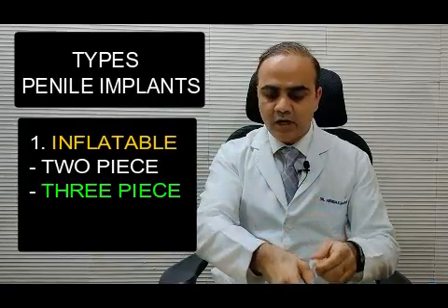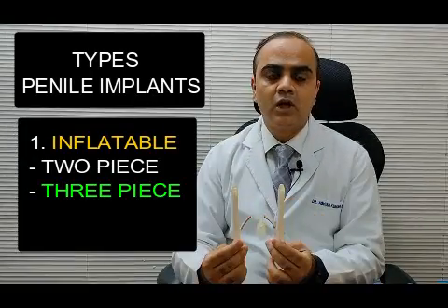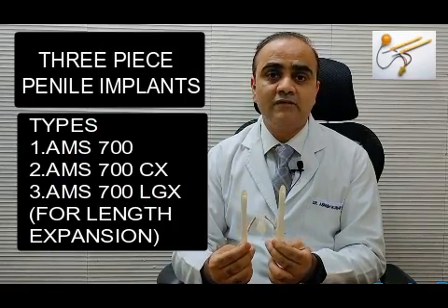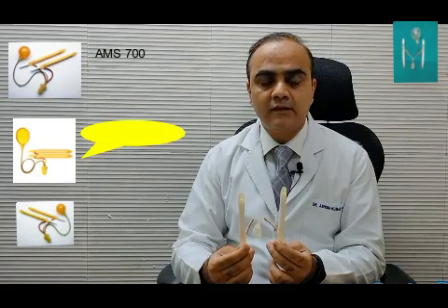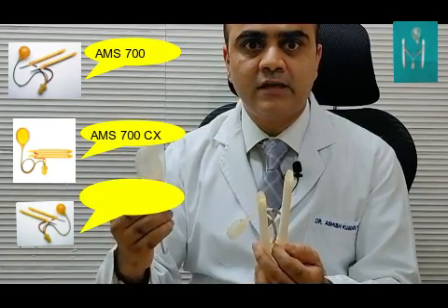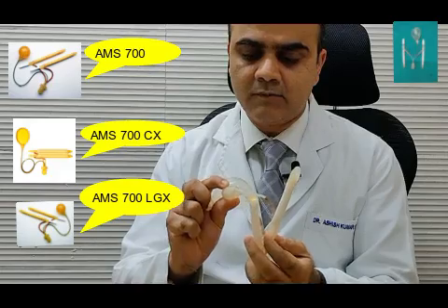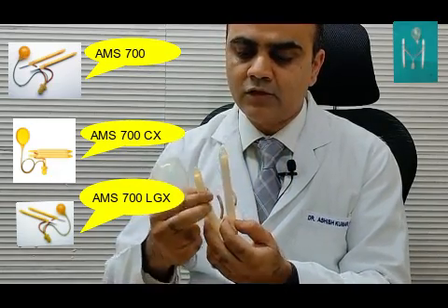The other implant, which is way beyond this, is a 3-piece implant. Now we'll be talking about the 3-piece implant, and this is the best implant which is available. It can give you a girth expansion as well as a length expansion if you go for the LGX model. 3 pieces. So basically this is a reservoir which is placed in the right lower part of your abdomen, and this is the button which is placed in the area of the scrotum, and these are the 2 rods.